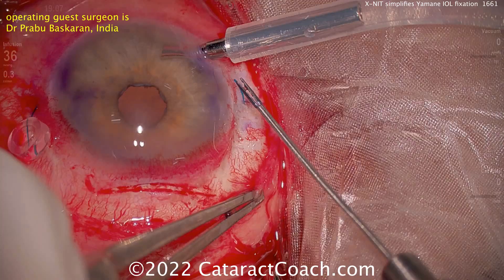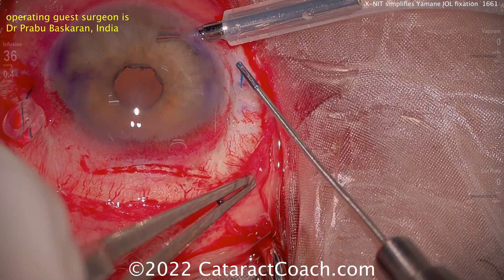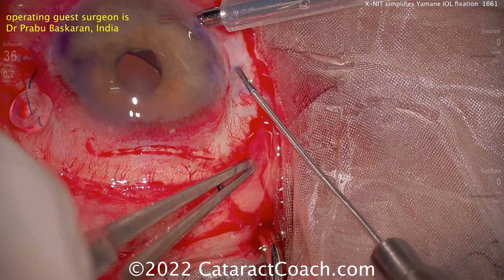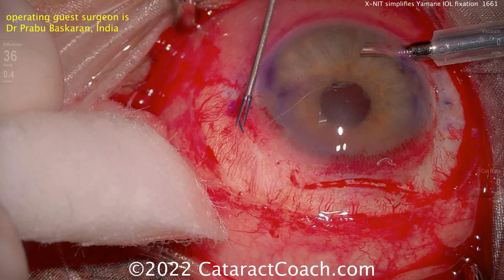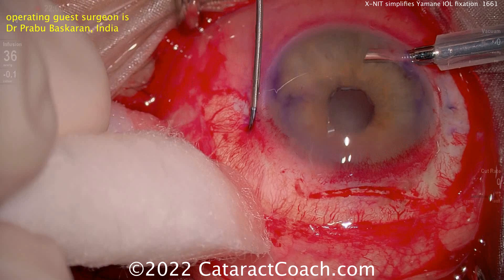You really avoid pushing the lens all up and down through the mid-vitreous. It's a much nicer technique. Now, it does require a larger incision — you can see the incision on this side is a little on the large side because it was a manual extraction. In this case, you're not folding the lens back and forth. There's the haptic — you can create a flange if needed and get it tucked in, or you can simply tuck it in. A flange is the preferred technique, as Yamane does, and you can put the flange down the tunnel for a nice secure positioning of the lens.